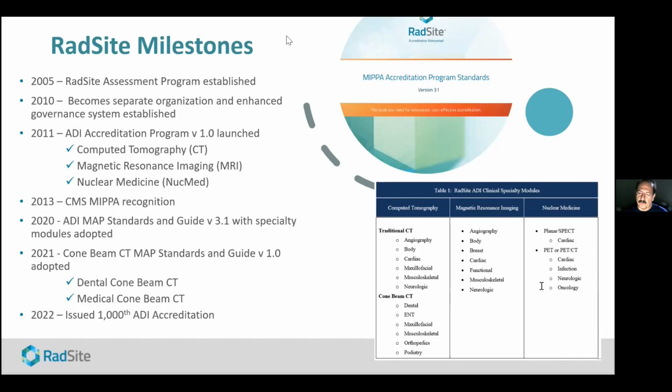Other modalities in cone beam include ear, nose, and throat imaging studies and maxillofacial imaging studies. Sinus evaluation would be one of many examples, but also musculoskeletal imaging, including the knees and feet and hands, and orthopedics in general, and then of course podiatry as well.